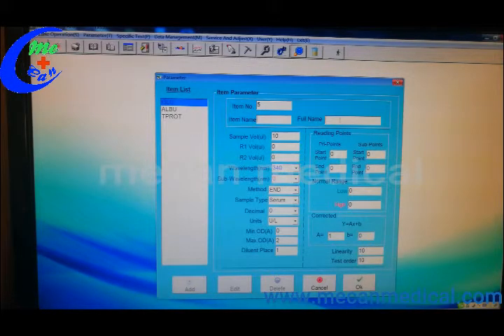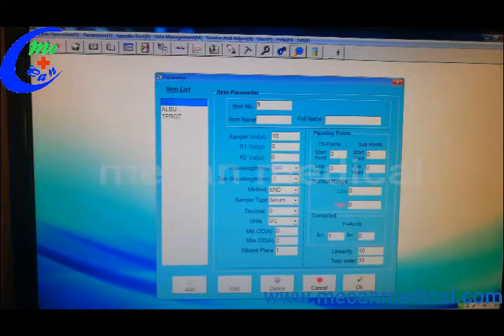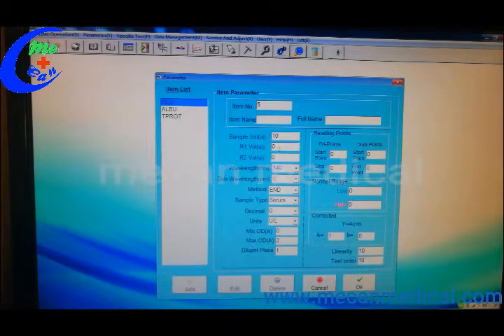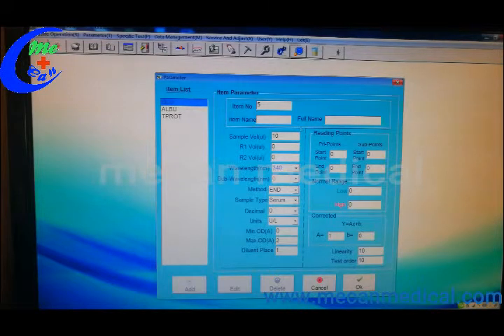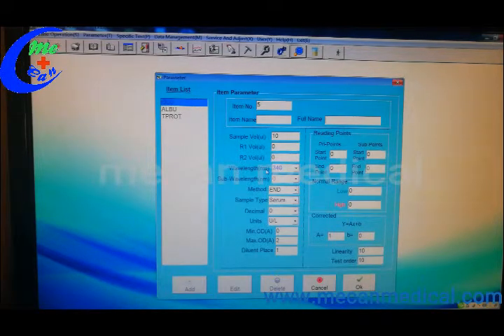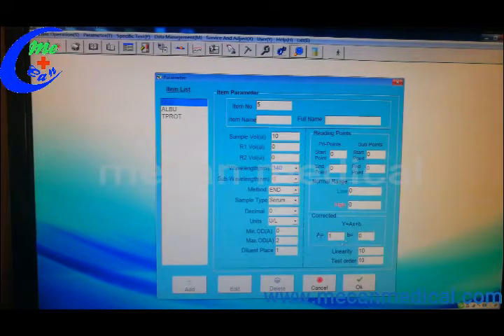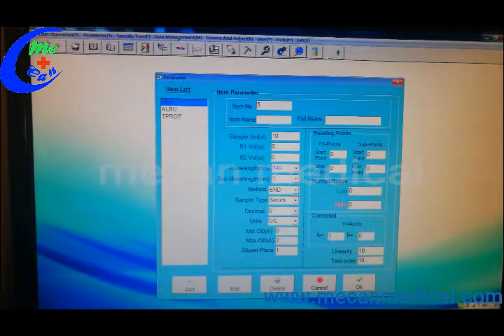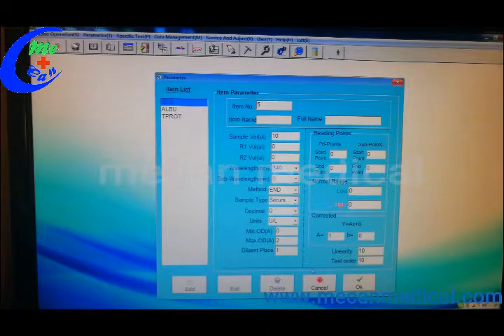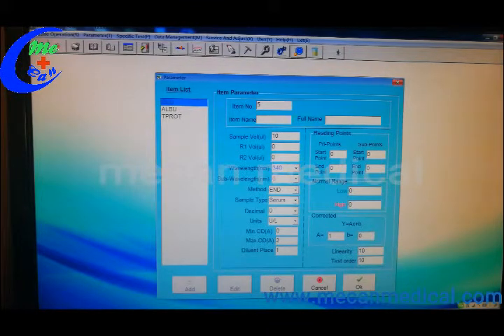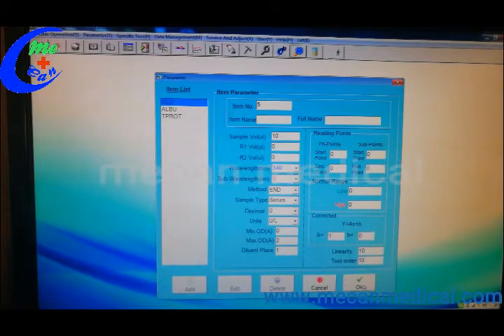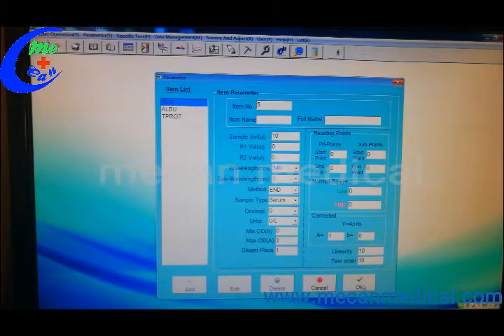Item name, full name, sample volume, R1, R2. All this information you can find in the reagent specification. Once you edit this item, you can click OK to save it.